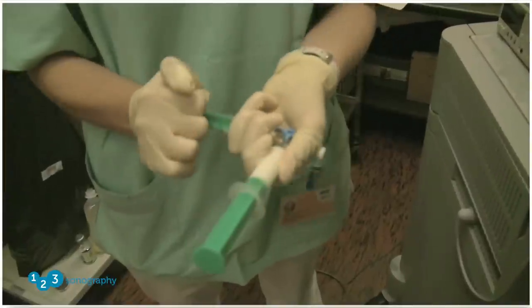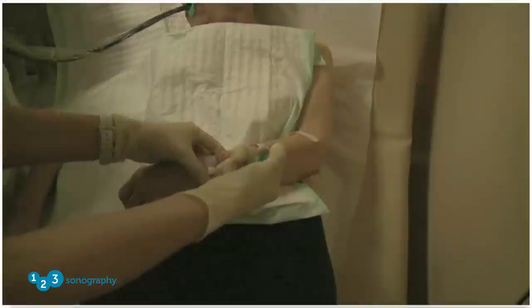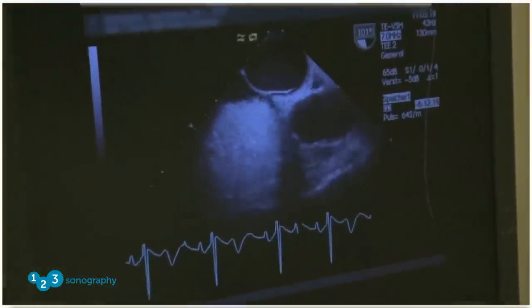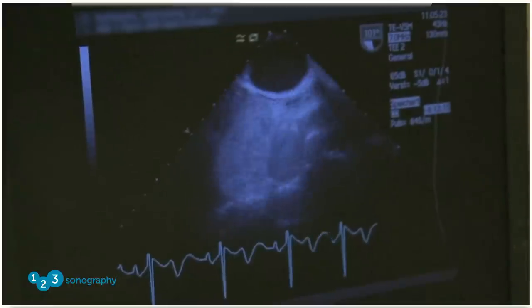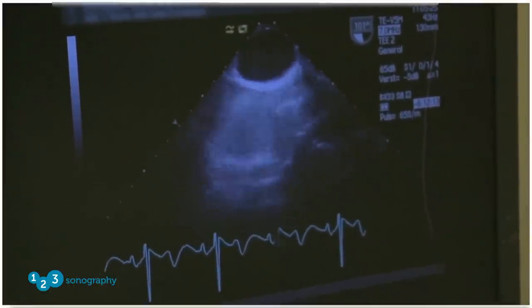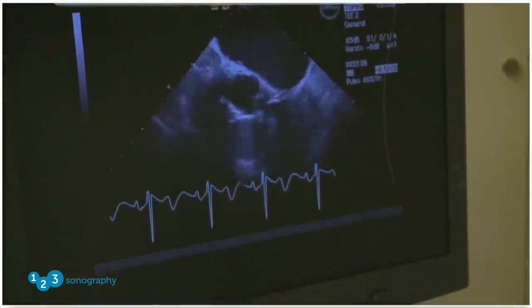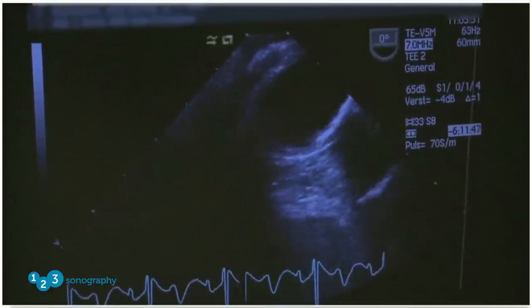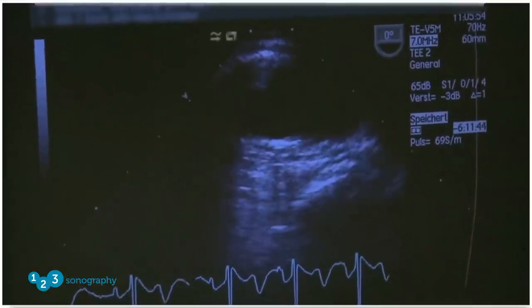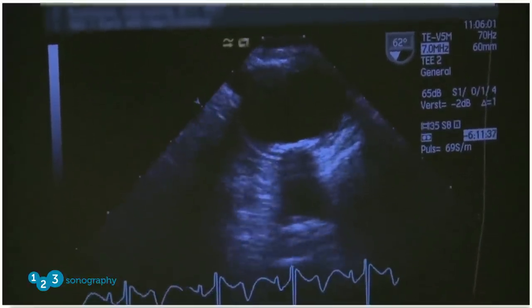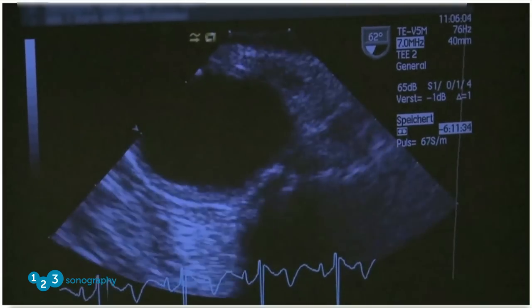Something we perform in every patient is a contrast exam. We use oxypolygelatine, a colloid substance — we put it in a syringe and agitate it between two syringes to get a lot of bubbles. We've injected the contrast, it comes in through the SVC, and this is how we check for a patent foramen ovale — a standard procedure in every patient. We also always retrieve the probe looking at all sections of the aorta. In this case, there is a rather large plaque in the aortic arch.